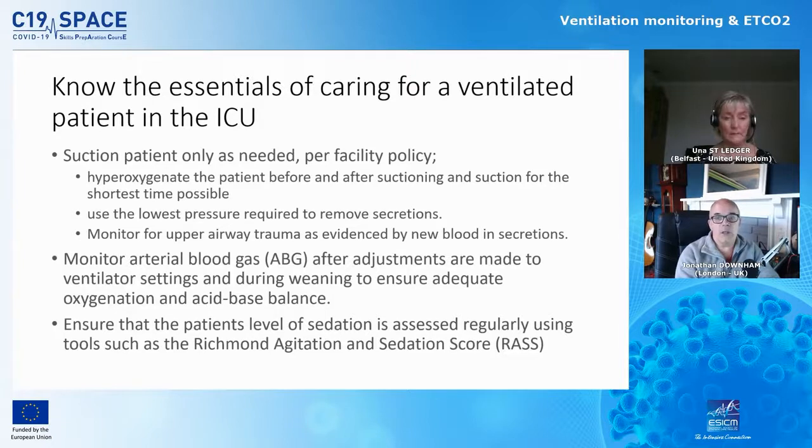Suctioning the patient is something that we will do very frequently for our patients. Obviously, they can't clear their own secretions because they've got a tube bypassing their vocal cords. They can't get the positive pressure to cough up their secretions. So we do need to suction them. These days, we tend to use what we call inline suction. So you don't have to actually break the ventilator circuit at all in order to suction them, which is important for things like infection control. And you'll be shown how to use those if you're not familiar with them.